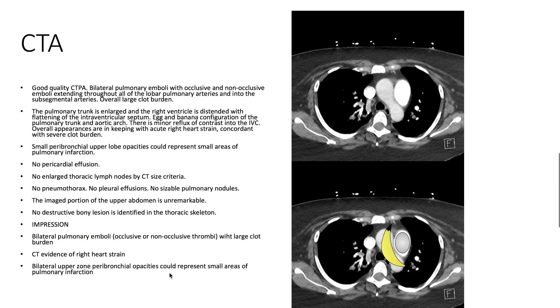On CTA, the patient is noted to have bilateral pulmonary emboli, both occlusive and non-occlusive, extending throughout all of the lobar pulmonary arteries and into the subsegmental arteries.